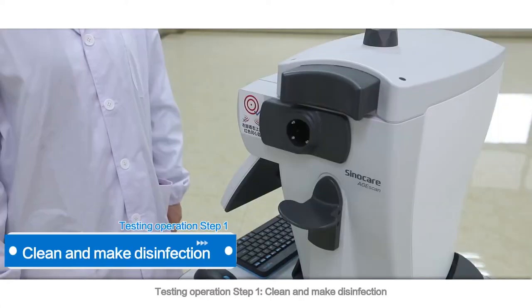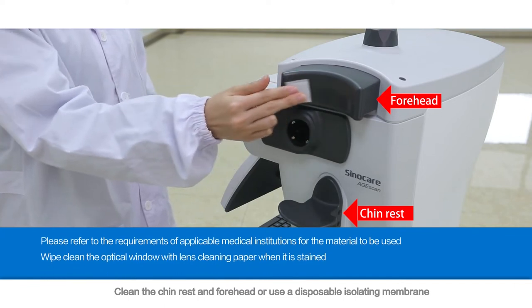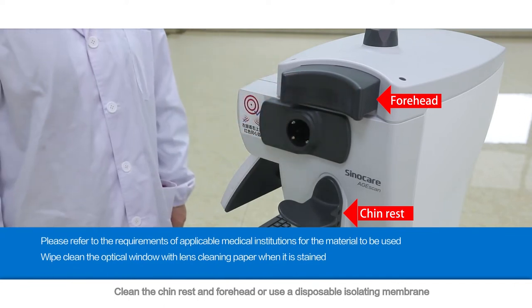Testing Operation Step 1: Clean and make disinfection. Clean the chin rest and forehead, or use a disposable isolating membrane.